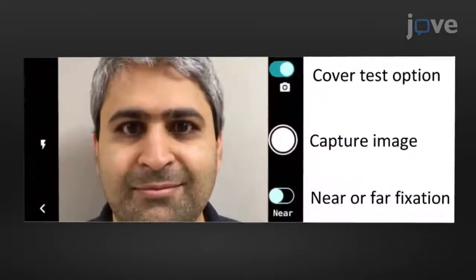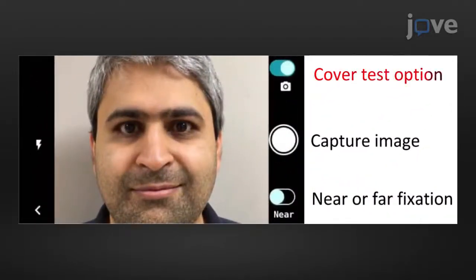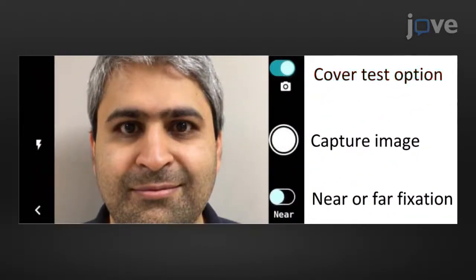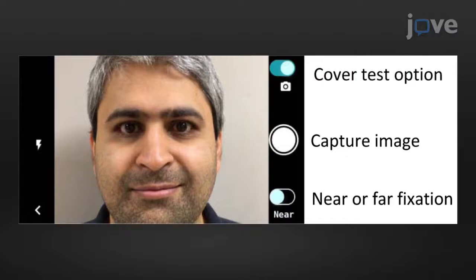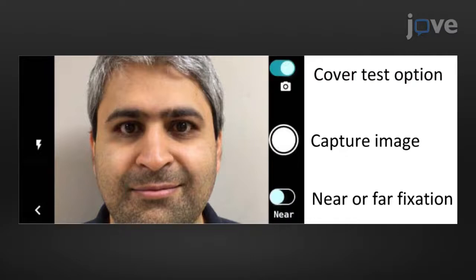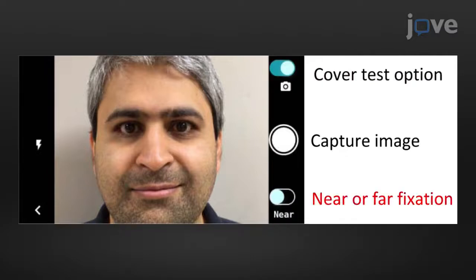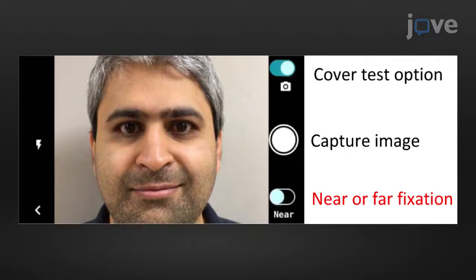In the app interface, users can choose to perform a cover test or to measure a patient with both eyes fixated at a target simultaneously at either a near or far fixation distance.